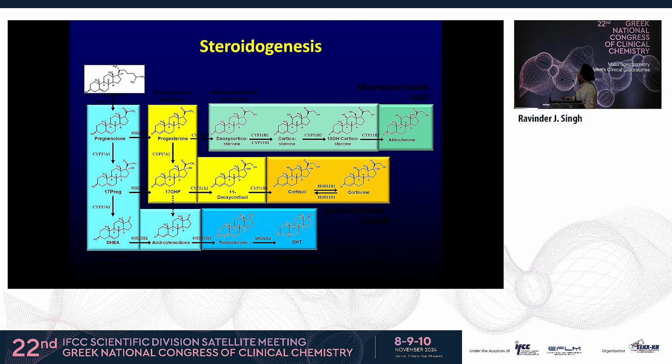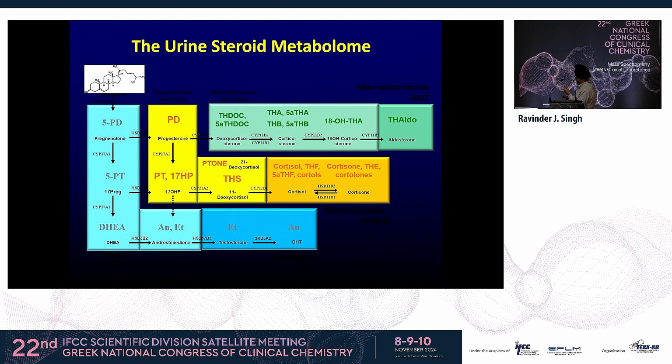So the hypothesis is there that as tumor is becoming cancerous, the tumor cells will not mature all the way. Some tumor cells will stop here, so they may not have these compounds. They may not have these compounds. They may only have 11-deoxycortisol because the cells are dividing too fast and too quickly. They are not fully maturing. So 11-deoxycortisol is one of the possible biomarkers for malignancy, but instead of just looking at this, now the method is looking for all of them to improve the sensitivity and specificity of the diagnosis.